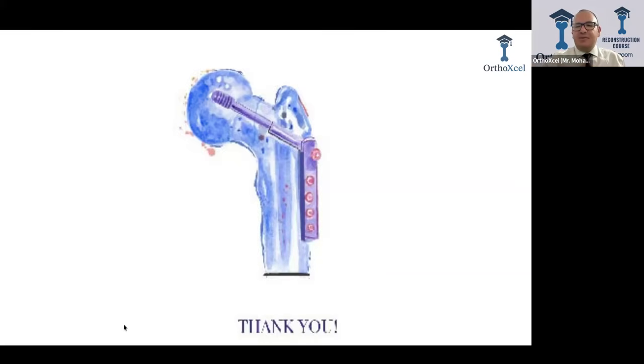So answering your question, Ahmed, there is no way to change one of them without the other. But clinically, you think about changing mainly the offset with minimal change of the length, or changing the length with minimal change of the offset. So clinically, it shouldn't affect your operation. Any more questions, guys?